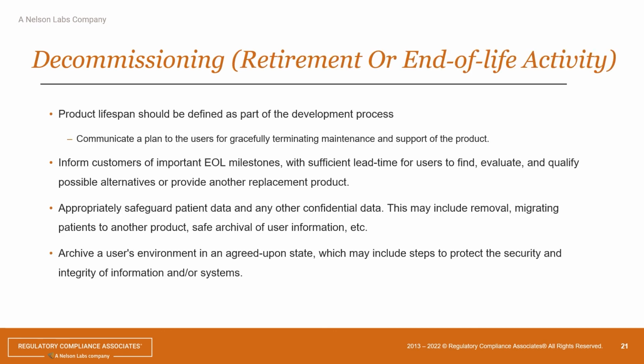All good things need to come to an end at some point in time. Over the years, whether you have another product that replaces it or you're getting out of the market after many years, you just have to keep in mind that there is a process to retire your product. You've got to inform the end users when you're not selling anymore and at what point you're not servicing it anymore, so that they have an opportunity to move over if you have a replacement.